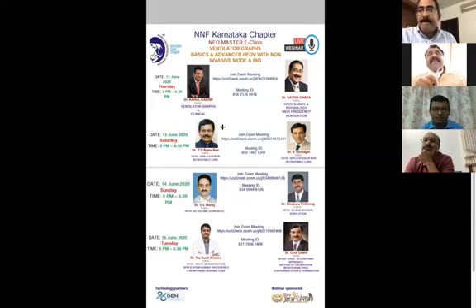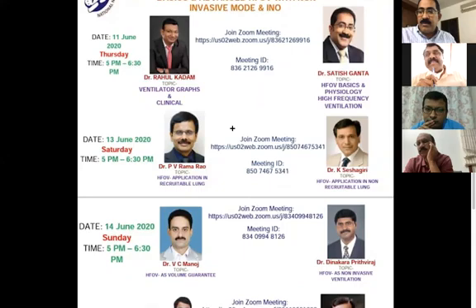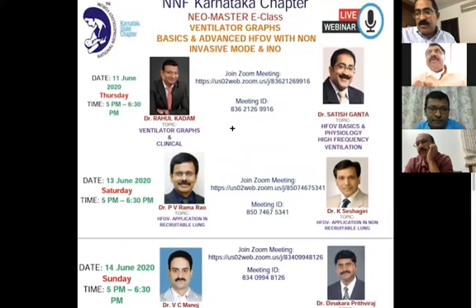If the time constant is very short, which means atelectatic lung or low elasticity and compliance, meaning there is an alveolar problem, in that lung I use high frequency, because I will deliver low tidal volume.